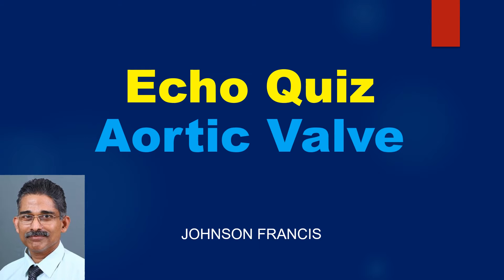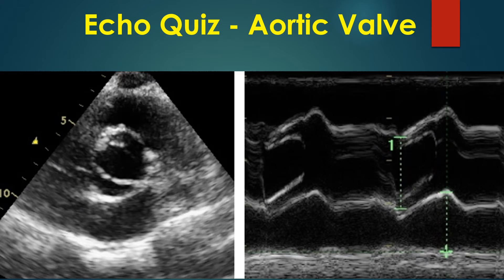ECHO quiz on aortic valve in parasternal short axis view and M-Mode. Here are two images of aortic valve: one 2D echo in parasternal short axis and another M-Mode tracing at aorta-left atrium level. What are the findings and interpretation?